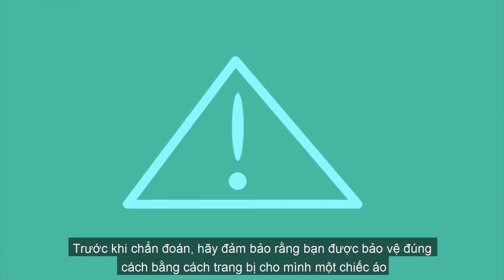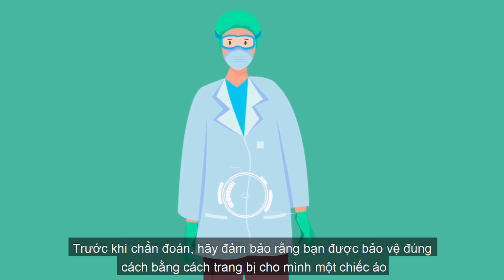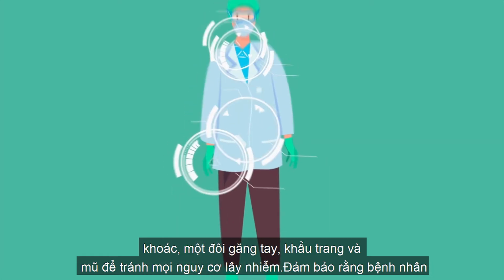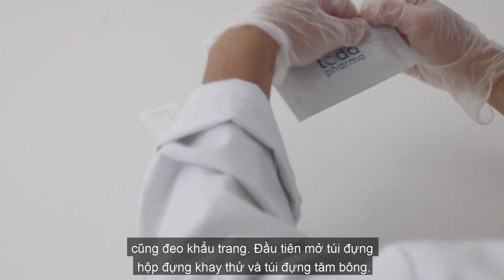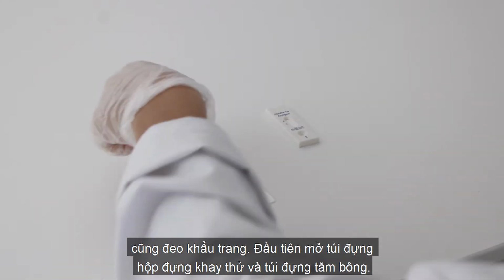Before making the diagnosis, make sure you are properly protected by equipping yourself with a coat, a pair of gloves, a mask, and a hat to avoid any risk of contamination. Make sure the patient also wears a mask. First, open the bag containing the test cassette and the bag containing the swab.